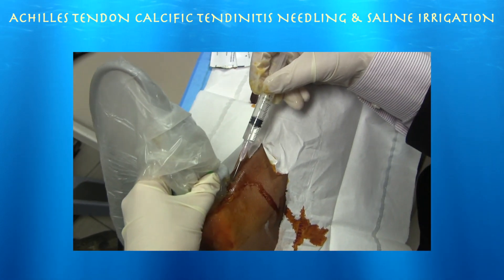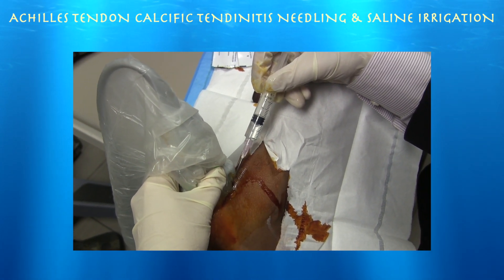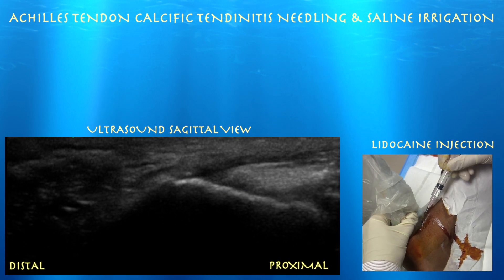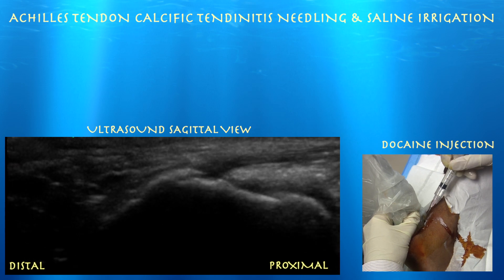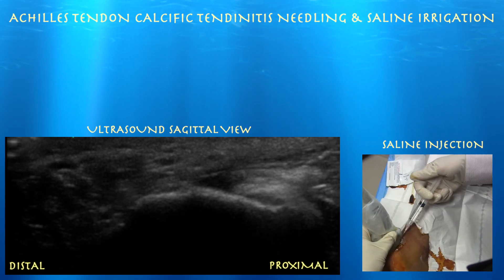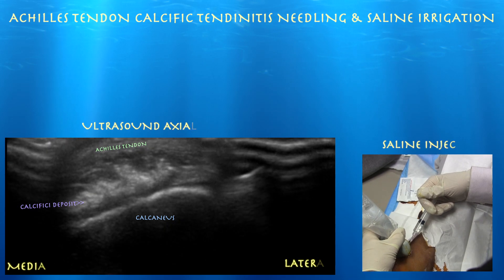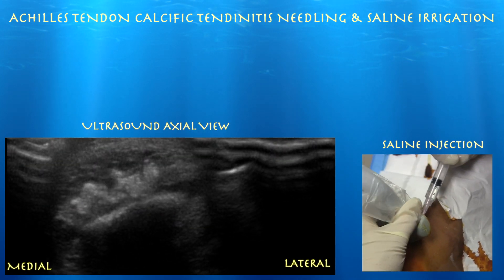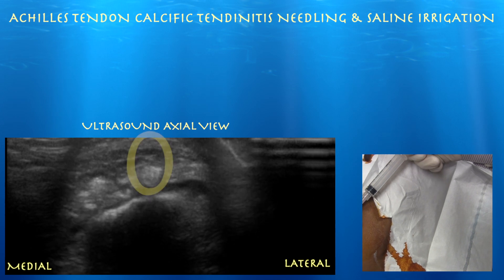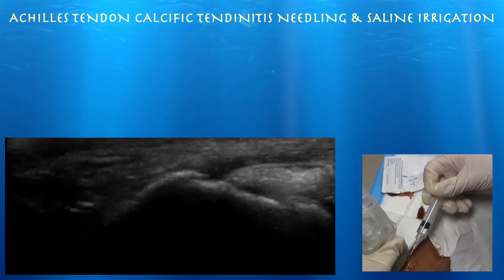We are going to try to drain this calcium deposit. I kind of felt it when I went in with the needle. Here we are injecting a little bit of lidocaine around it. Left side of the screen is medial, right side is lateral. You can see that the needle is basically right in the middle of it. Here I am just trying to break up this calcium deposit with the needle. I don't believe we really aspirated any calcium in this case. This is a case where I used a fair amount of lidocaine — otherwise I think you would have a hard time tolerating this procedure.